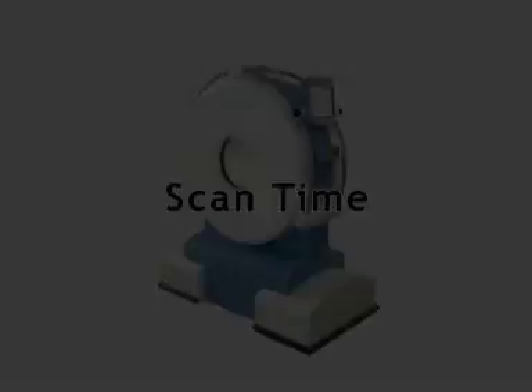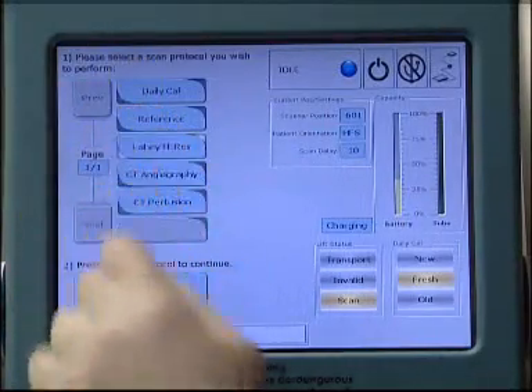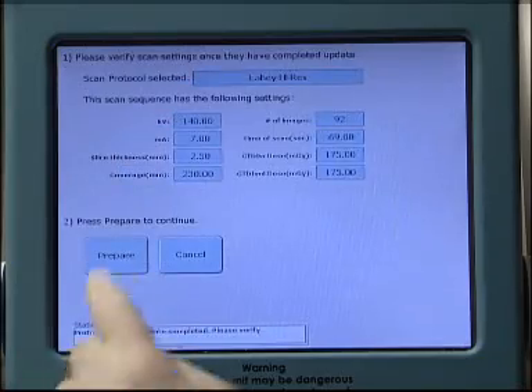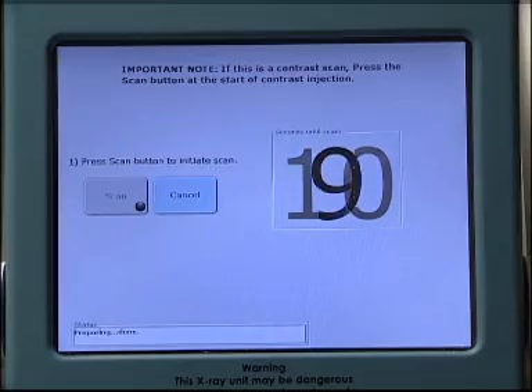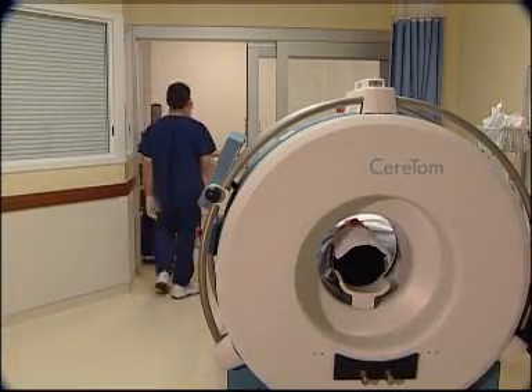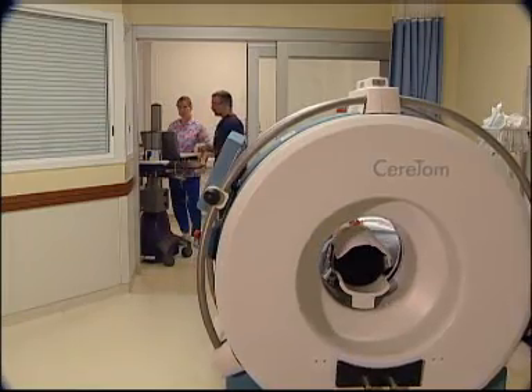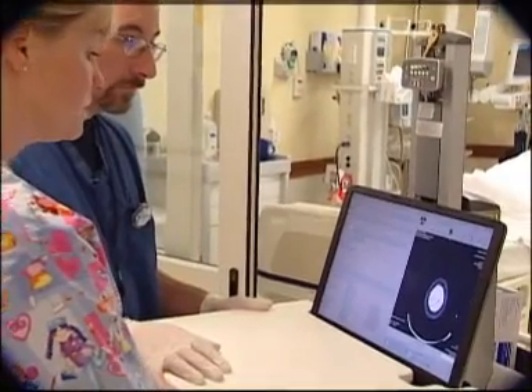Scan time. At the LCD screen, choose Select Protocol. Choose the Preferred Protocol, then choose Accept Protocol. Prepare the scan. Start the countdown for the scan to begin. Exit the room or stand at least 12 feet from the scanner. While the x-ray is being generated, images are sent wirelessly to the workstation for viewing.